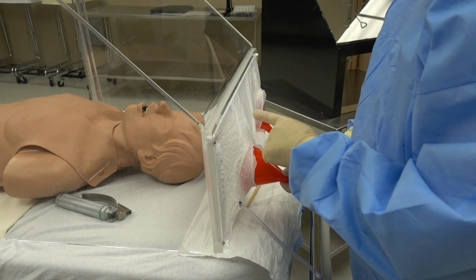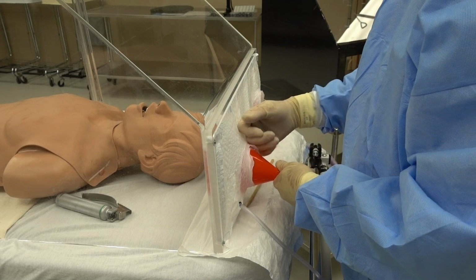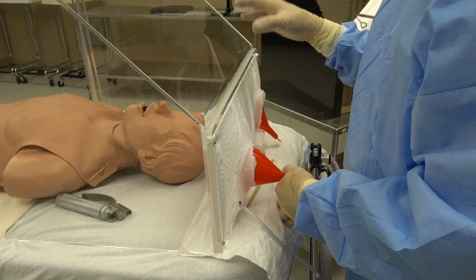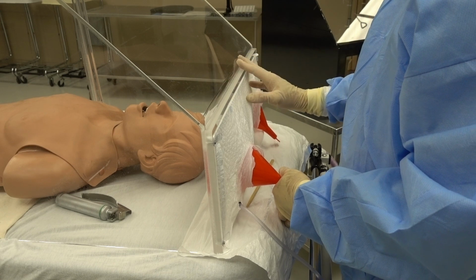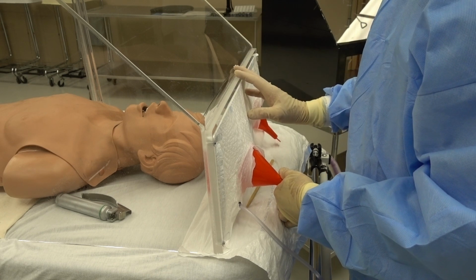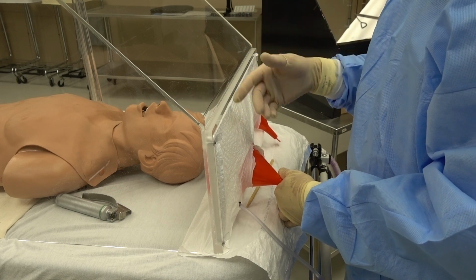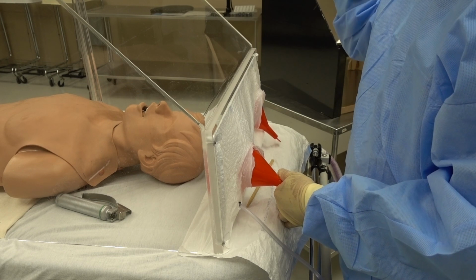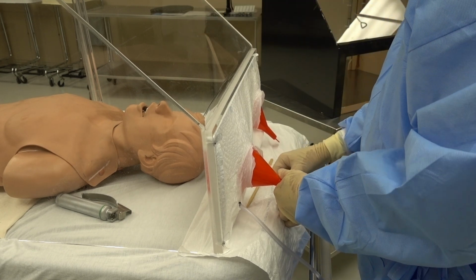And we're working on a disc, a magnetic disc that we just pull up and it'll be flat and put it on the other side, and then you can take them off much quicker. And again, if you ever have a difficult intubation, you can't do it, you just lift the chamber off and do it. But I think we're going to be able to do most people with this. I had a technician in here that had never seen anatomy, never used a scope. She did it the first time. You got great visualization. I was actually able to video through the screen and see.